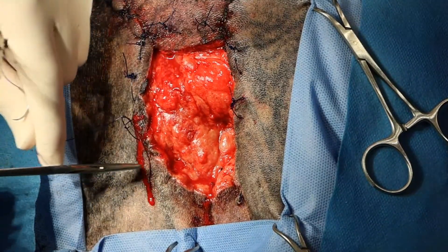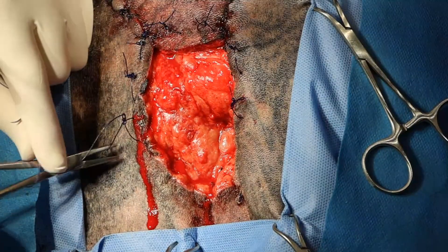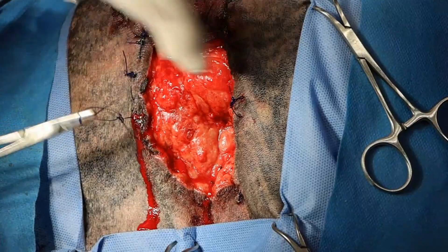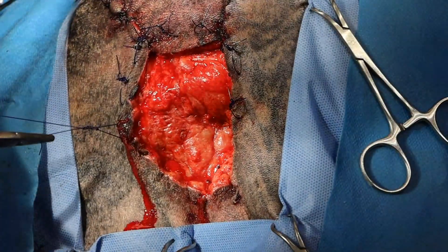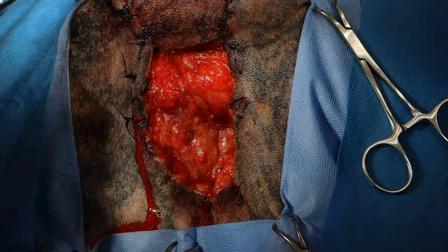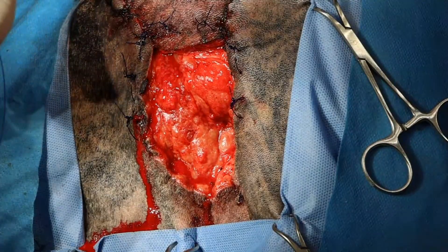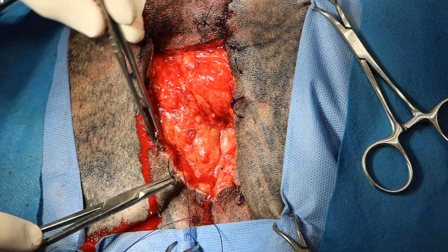The other thing you could consider doing here would be what's called gradual mechanical dermal apposition, which we may actually do in this case. It's a really cool technique where we just do a simple continuous suture pattern, and then every day we tighten it a little bit, and that'll gradually pull those skin edges together.